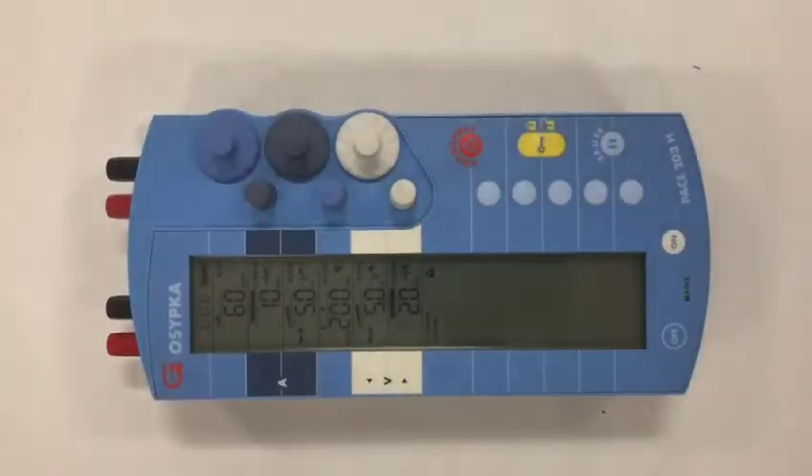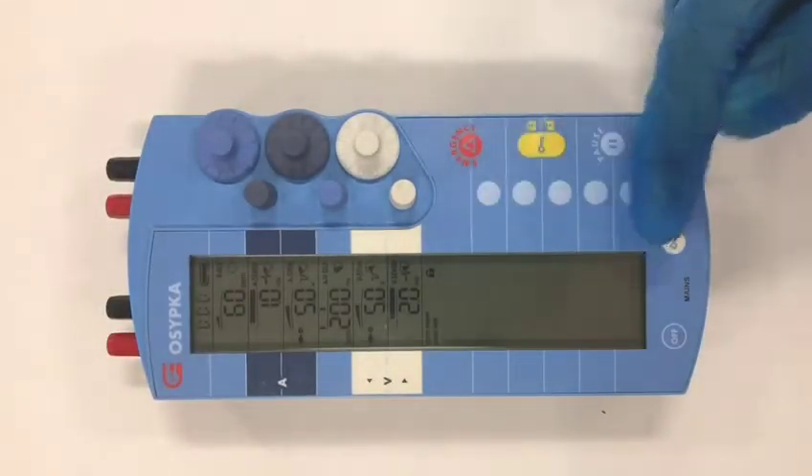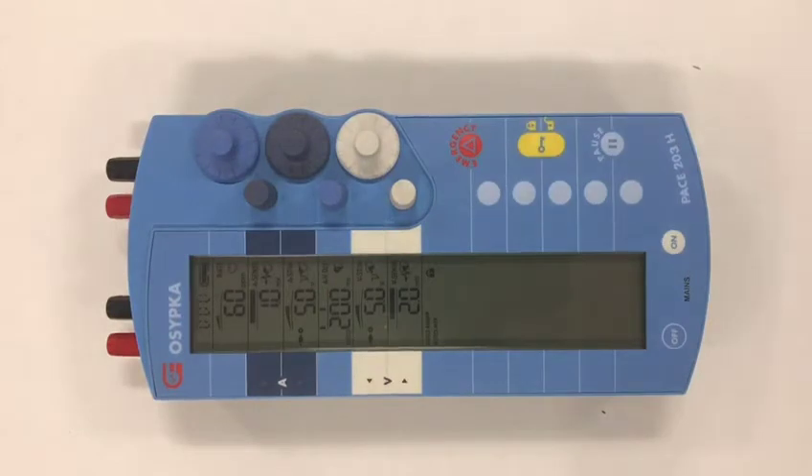These are the five things that you really need to know as a bare minimum for this device. The first is: if the device makes a noise, there will be a message. If the device makes a noise, don't ignore it — read the message, and the message will appear in this section. The two most common messages are: change the battery, or lead is disconnected.